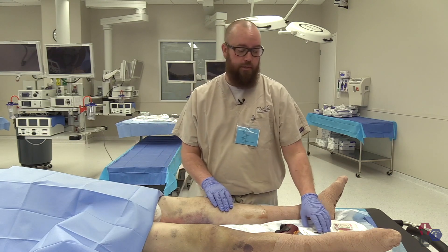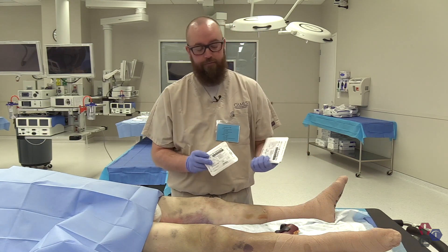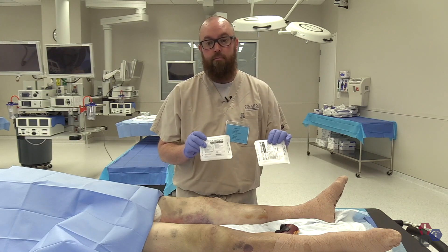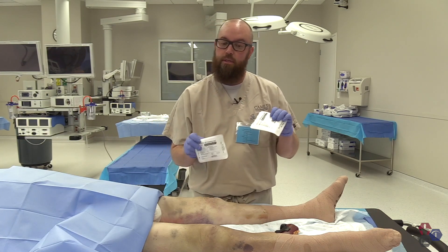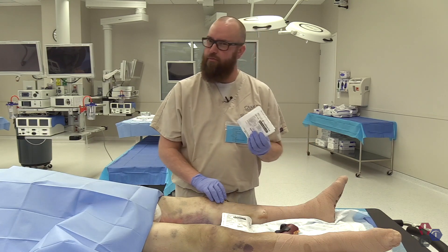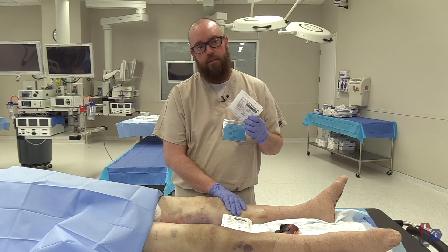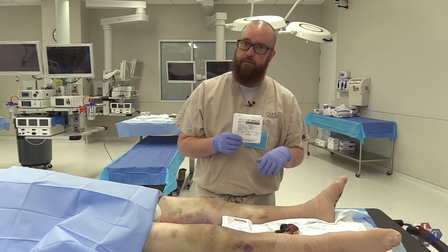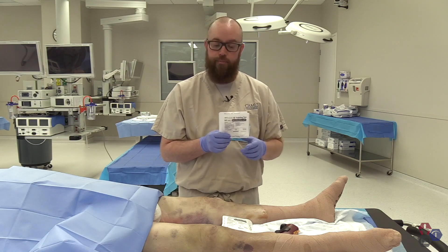There are two different size needles: a 25 millimeter and a 45 millimeter. They can be used in either place. The problem is that with the 45 millimeter, if you use it on the lower extremity, you're more likely to bury it into the posterior aspect of the cortex, making it an unusable line.